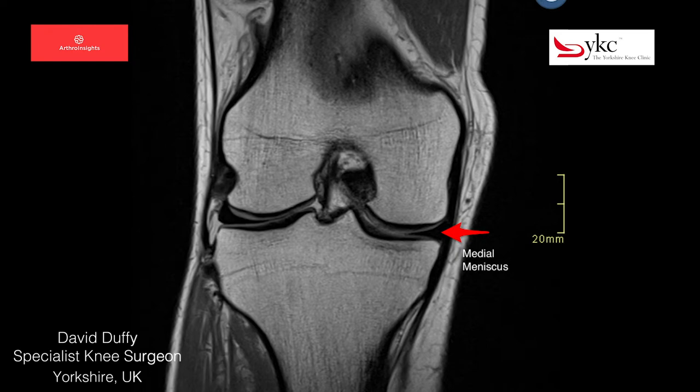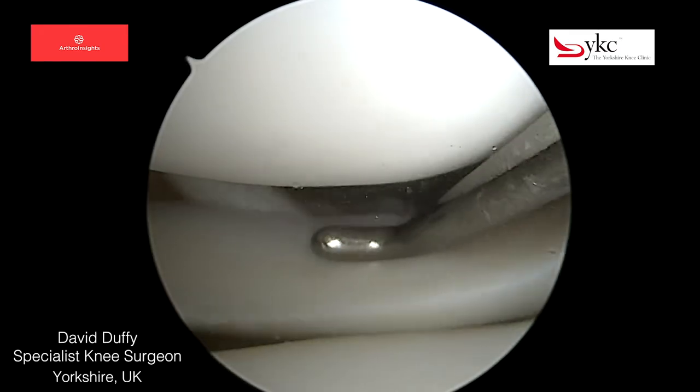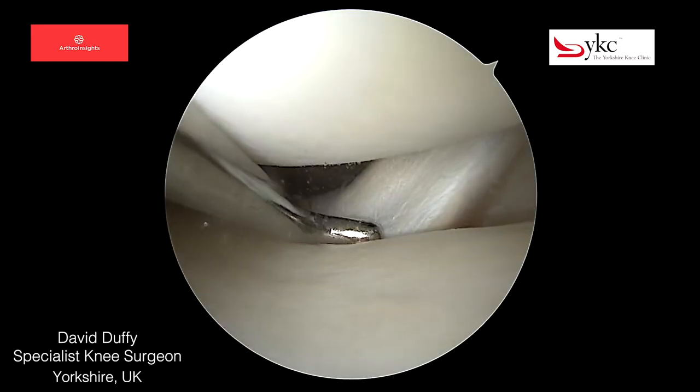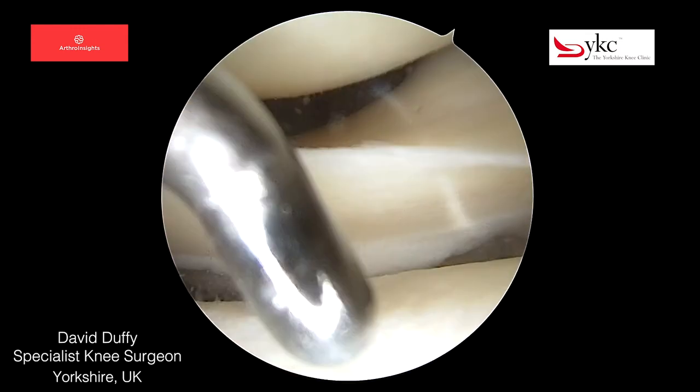It is the dark triangular structure here. I'm using a probe to examine a lateral meniscus. This differs from the medial side as it has an opening or hiatus to allow the passage of a tendon of the popliteus.